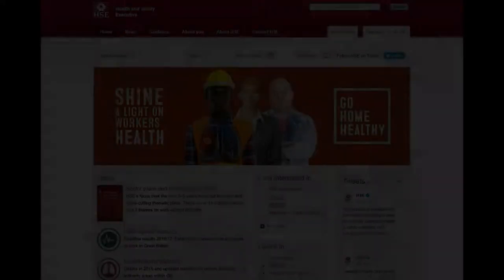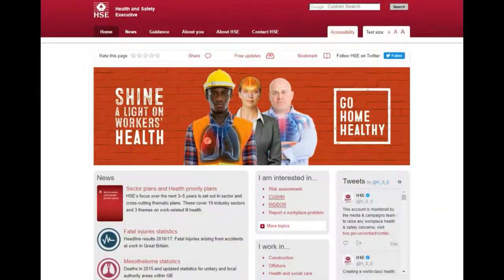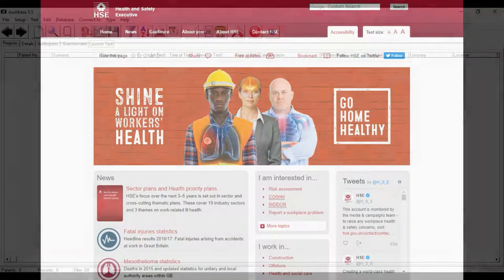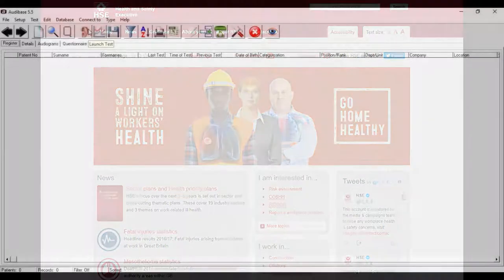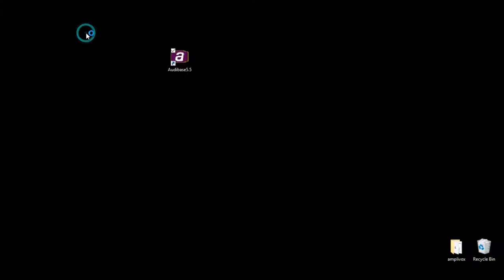This fast learner video will show you how to set up the auto test settings according to the HSE standard. Open Audibase and select the e-icon in the toolbar to start a new test.